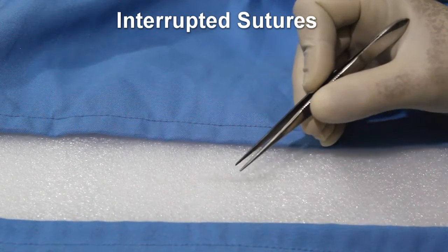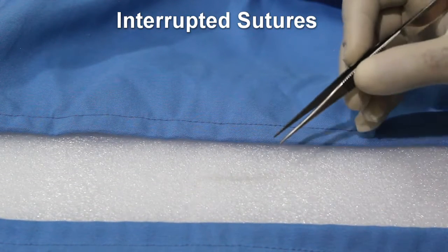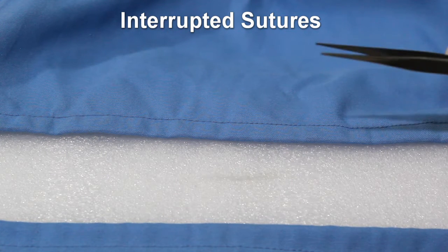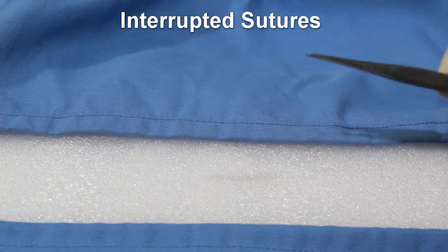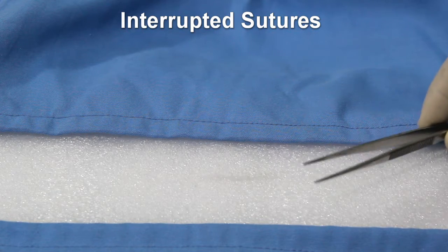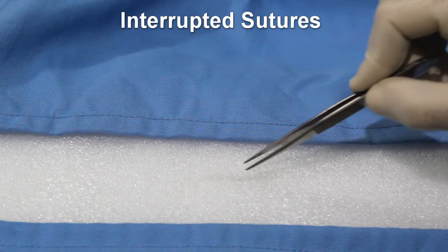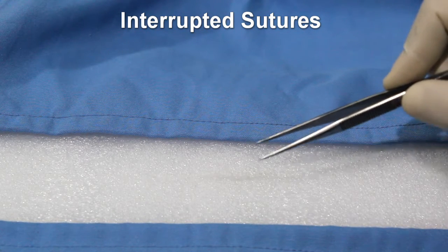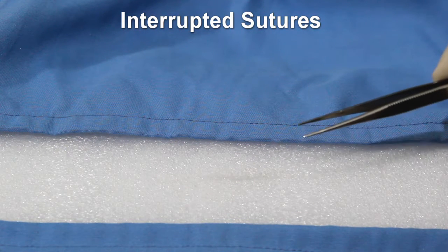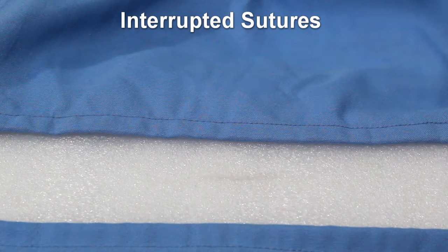In the field of practical surgery, the suturing technique is the most basic skill. The goals of suturing are: wound edge approximation, providing adequate tension, maintaining hemostasis, aiding in wound healing, avoiding wound infection, and producing an aesthetically pleasing scar by approximating the skin edges.